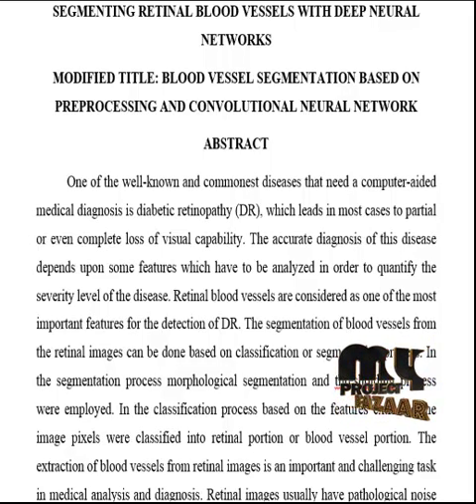The process of extraction of the blood vessels is initialized by the pre-processing of the retinal image. Pre-processing is employed in two stages based on global contrast normalization and zero phase component analysis. The pre-processing step enhances the input images, which are then used for the extraction of the features. It is also helpful for the normalization of the intensity in the overall input images.